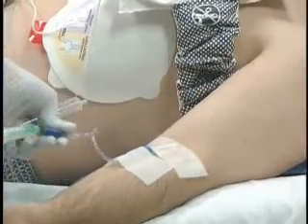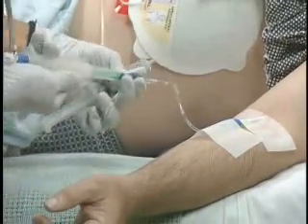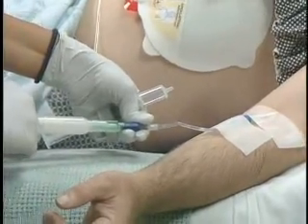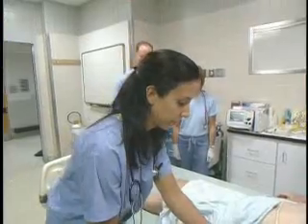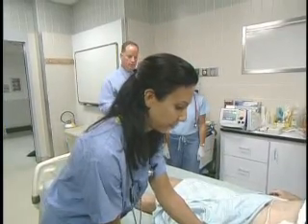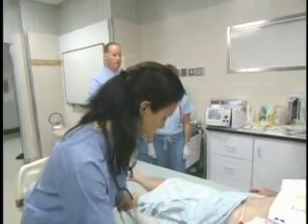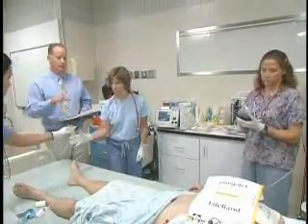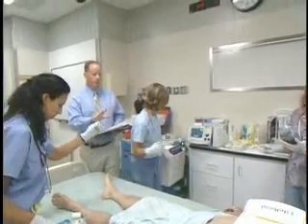One milligram of epi — let's circulate that please. I'm giving the epi right now. Is that the second round or the first? The first epi. Let's circulate that for a few minutes, then pause the auto pulse and see what the underlying rhythm is. That looks like asystole — let's restart the auto pulse please.